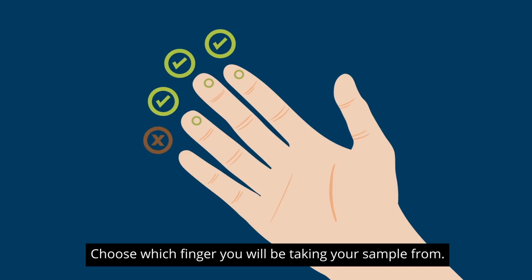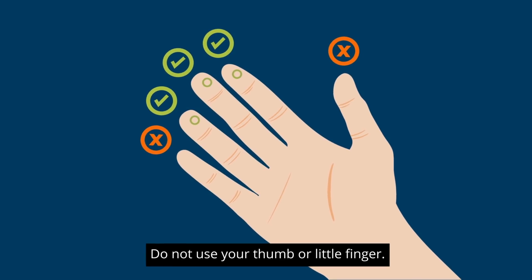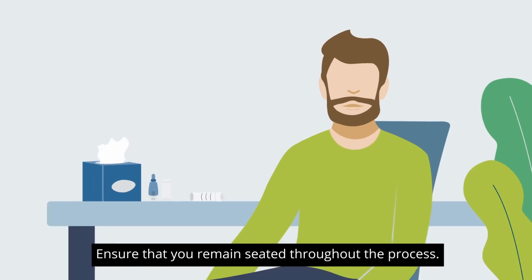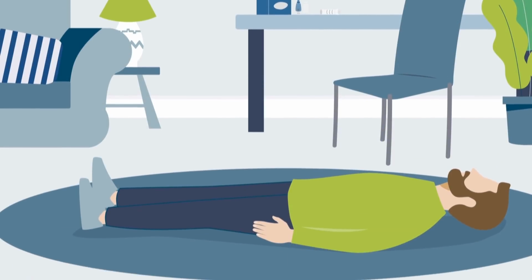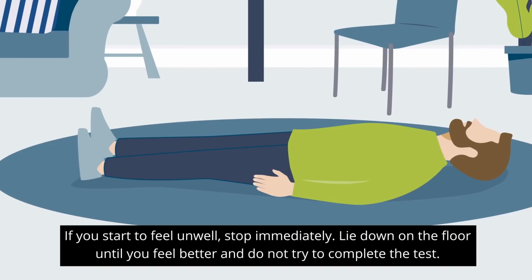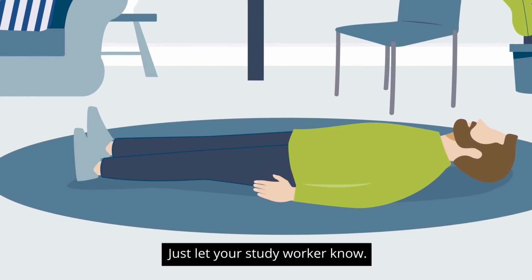Choose which finger you'll be taking your sample from. Do not use your thumb or little finger. Ensure that you remain seated throughout the process. If you start to feel unwell, stop immediately. Lie down on the floor until you feel better and do not try to complete the test. Just let your study worker know.